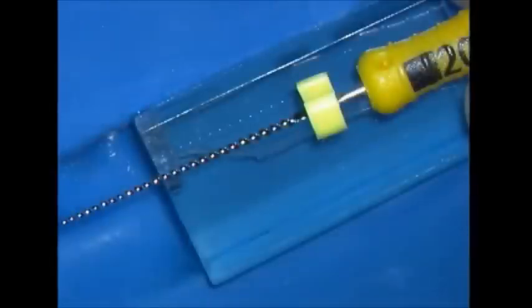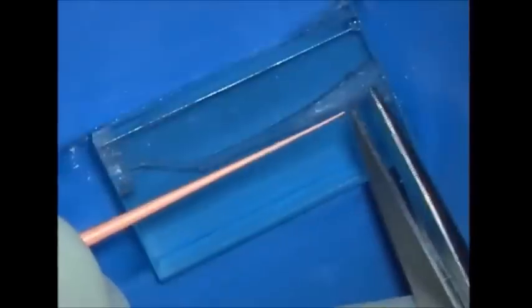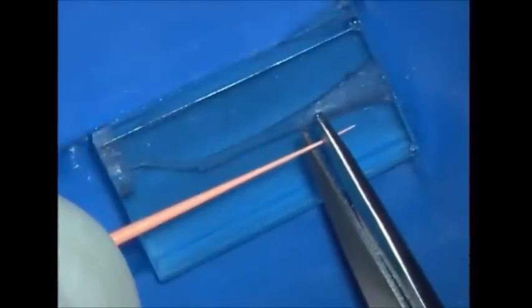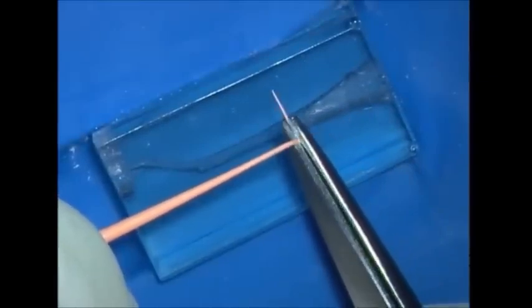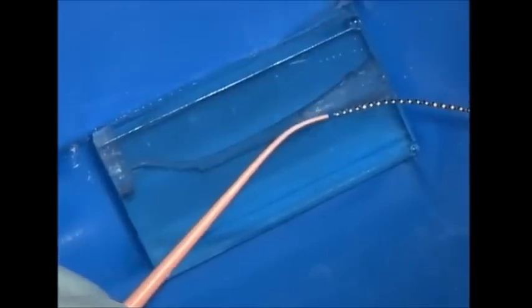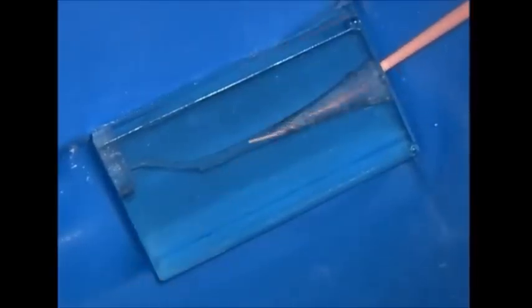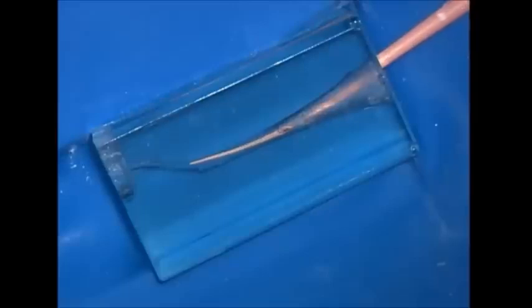Following the use of the Finisher 1, we gauge with a 20 hand file. Again, we trim a non-standardized medium master cone such that its terminal diameter matches the last file that was snug at length. This master cone can be put in a dappen dish of alcohol to encourage it to hold a curve, and we'll look at this in just a little bit.